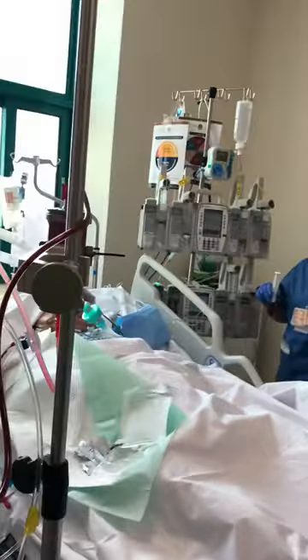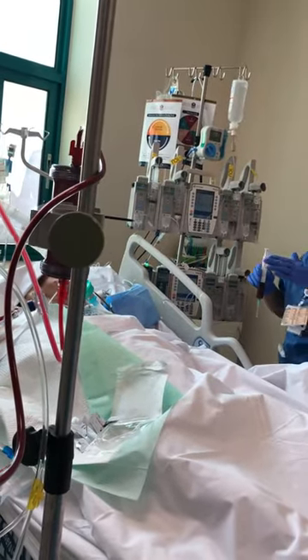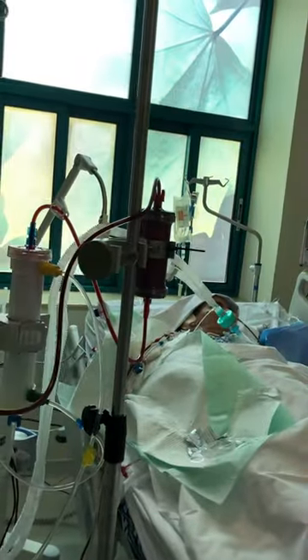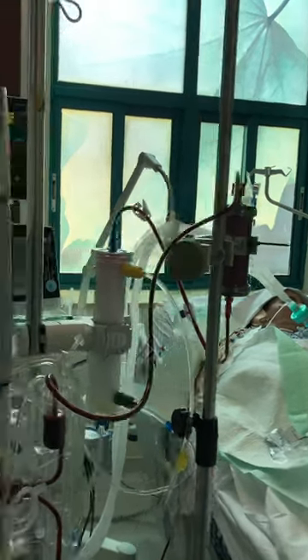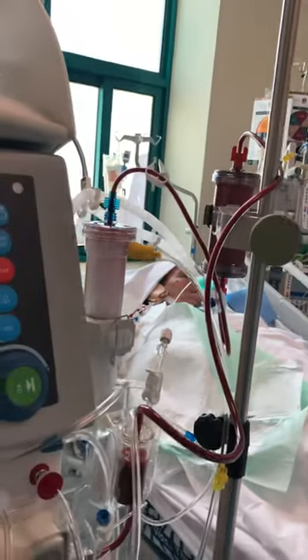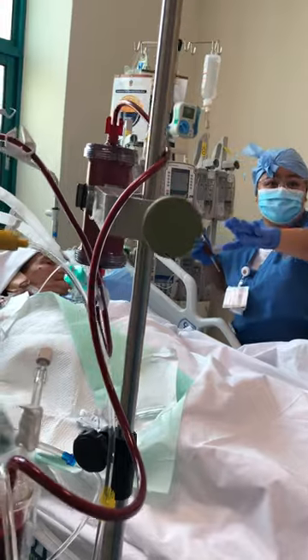What if the patient arrests and we need to recirculate — we need to return the blood? Same procedure as while we are returning the blood, because it's bi-directional. We can reuse this one. If we reprime again for the patient, can we still reuse it?